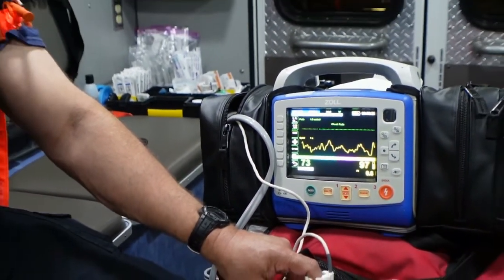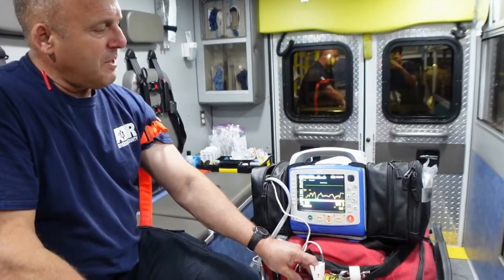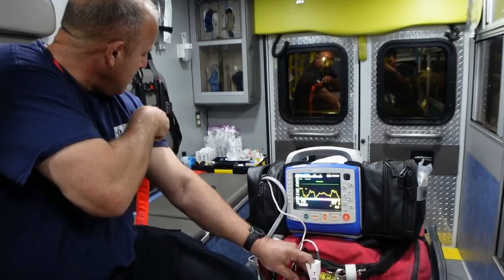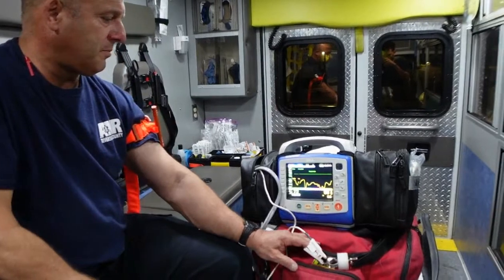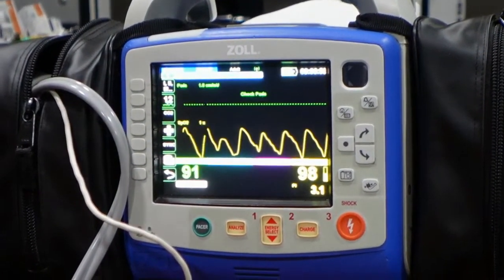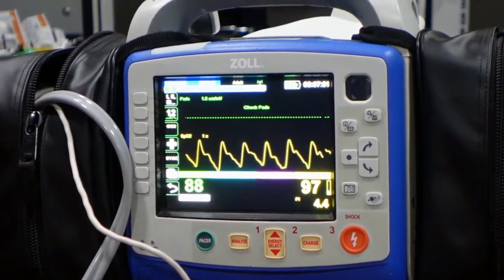Teachers out there, you might take note that I applied an arterial tourniquet to my arm and my arm isn't falling off, nor am I dying, nor am I screaming and wailing and gnashing my teeth in pain. By the way, if you're watching this, you've also had a tourniquet on your arm — just think of the last time you had a blood pressure taken. I'm going to release this now, and let's see what my Pulse Index does. The Pulse Index increases to 3.6, 4.4, so now that saturation is an accurate one.